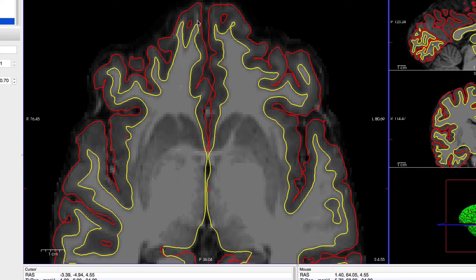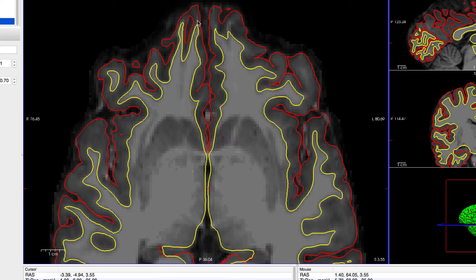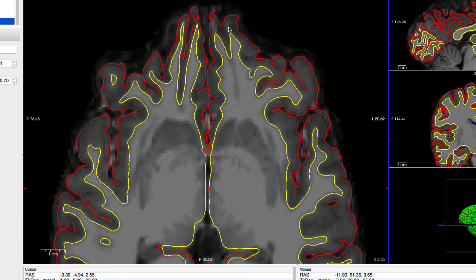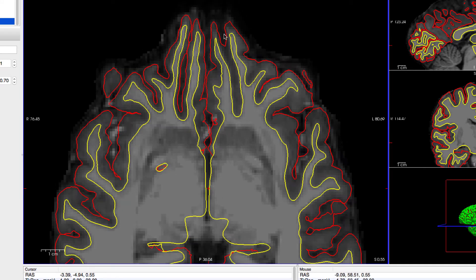Add control points by left-clicking voxels that you think are white matter but aren't included in the white matter boundary. Space out each control point by at least a couple of millimeters and do them for each slice that contains the error.